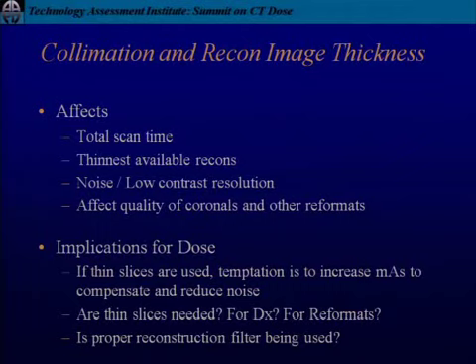And it'll vary. Even in abdomens, it'll vary from time to time, from the indication for the exam in the first place, right? So I'm sorry I don't have a blanket answer for you, but I agree with your principles. If you're looking for a fluid collection, you could probably knock down the mAs. If you're looking in a cancer patient to see if there's a new lesion that might have popped up somewhere, even something subtle, you may not want to reduce the mAs. You may need the thin slices and the higher mAs. I wish I could give better guidelines, but I hope we keep pushing back on our clinical colleagues to give us some guidance there.